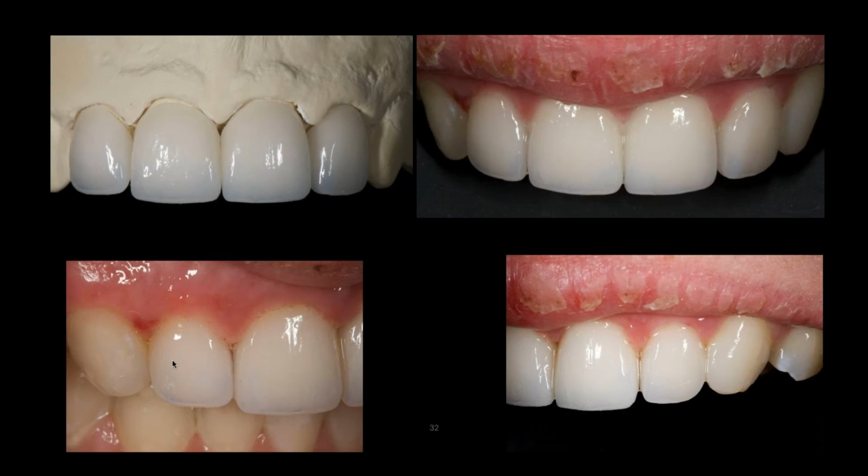And here you can see them in the mouth. This is the day that we put them in, so he's a little irritated. You see his lip here that's dry? This fella had acne, and this is Accutane, which is a medicine for acne, but it really dries you out. They took it off the market because it had a higher suicide incidence, so that's why he's like this, not that we tore him up. But you can see how close you can reproduce these things with minimal room.